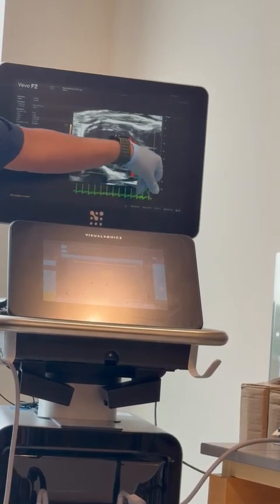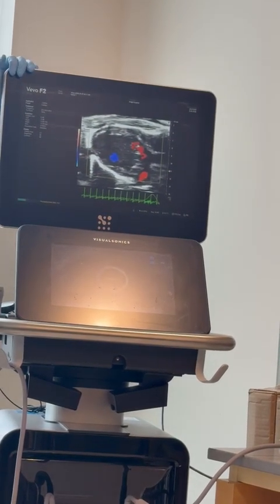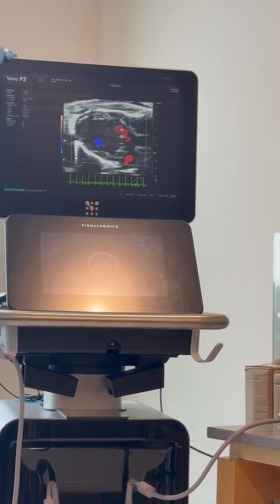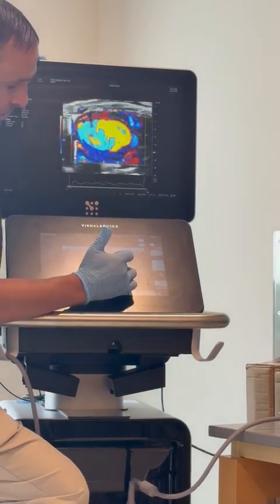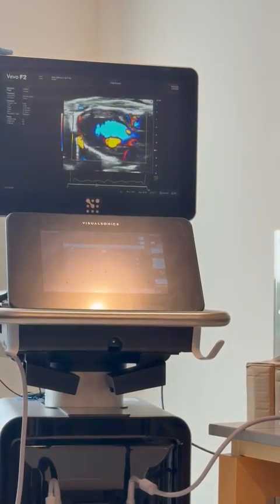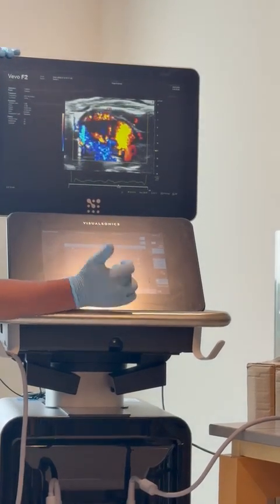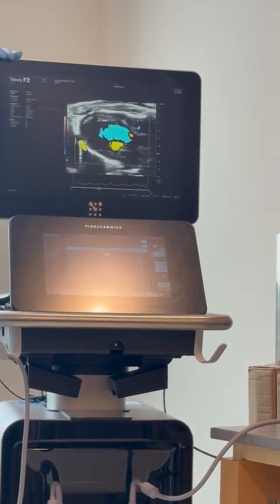It's also a nice way to visualize the coronary artery coming off the aorta by using color and color EKV. So I need to adjust the thresholding a little bit, and we'll process it. And we can get rid of some of that background. And you can actually see that flow in the heart, right? So we can threshold a little bit more to get rid of some of that excessive coloring, and now we're actually just seeing a lot more information, right?